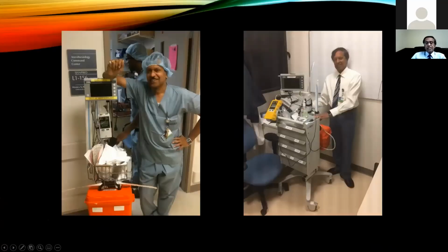That is the reason why many institutions, when they go for a code outside of the operating room, carry the capnograph so that we can measure the CO2 waveforms during resuscitation. And of course, we can also add a video laryngoscope, because we do not know which patient is going to have a difficult intubation during CPR.